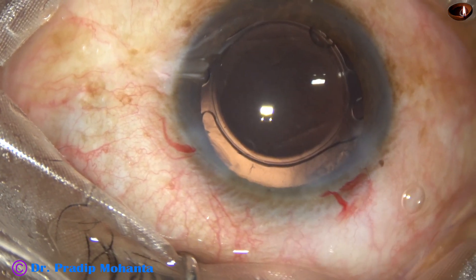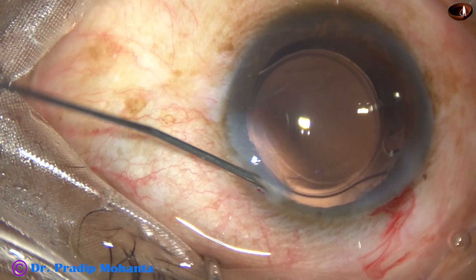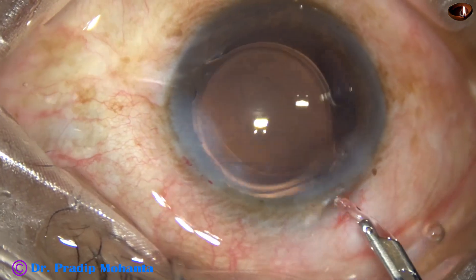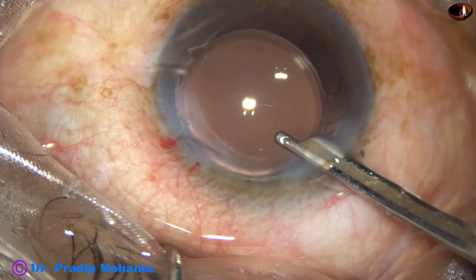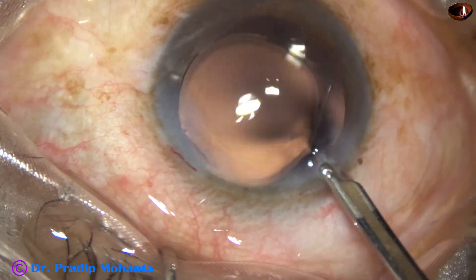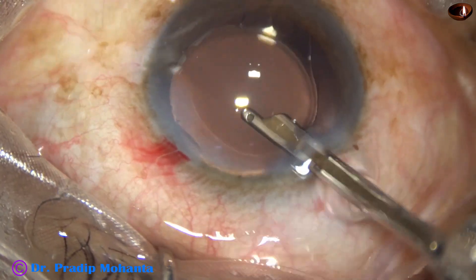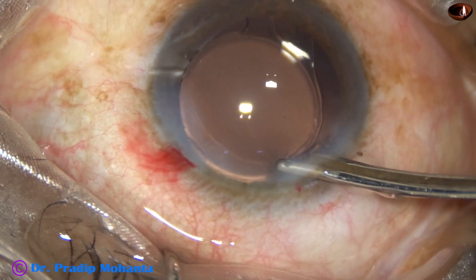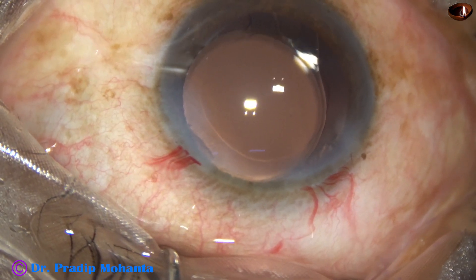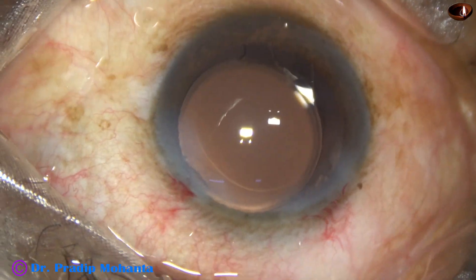One haptic is stuck to the optic, but it releases very soon. The side port is closed by hydrating the corneal stroma. For the final lavage, a gentle stream of saline is directed towards the corneal endothelium so that viscoelastic sticking to the corneal endothelium gets detached and released. The lens is placed nicely and the anterior chamber is formed nicely. Integrity of all wounds is checked with a cotton-tipped applicator, and a few drops of moxifloxacin are applied over the ocular surface. The case is concluded.